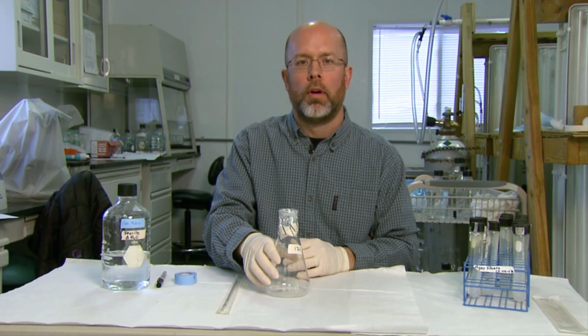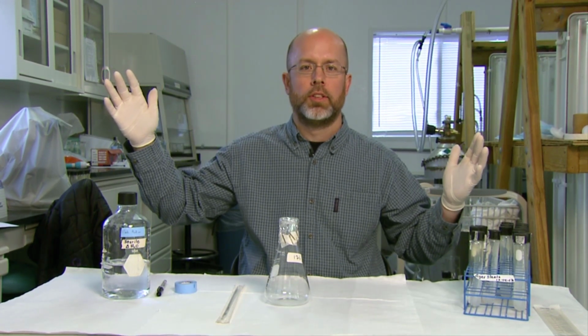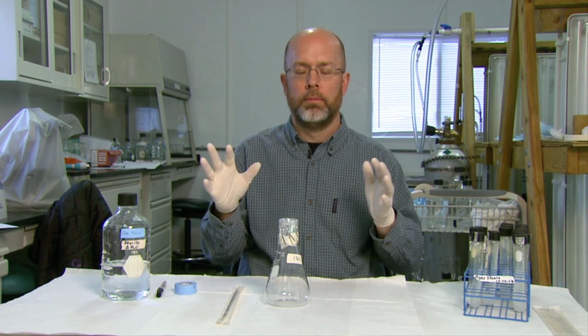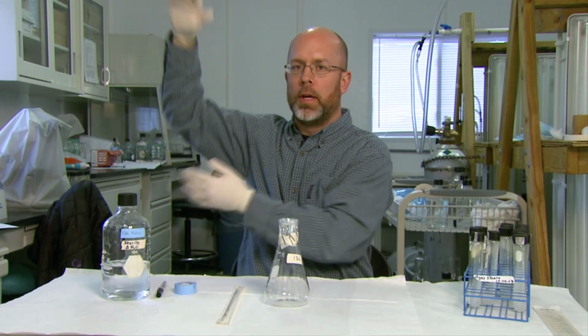As I mentioned before, with algae cultures, you have to step them up in size. The first step that we talked about was the slant culture. That's the smallest of the stepwise. If you went right from a slant to, say, a huge container, say a 1,000-liter container with that small inoculum, there wouldn't be enough algae in there for it to get started properly, and any light that's coming in, that UV light, is going to break down the cell walls. So it's important to just step it up little bits at a time, allow it to get dense in that next culture, move it up to a little bit bigger, allow it to get dense, move it up a little bit bigger, allow it to get dense.